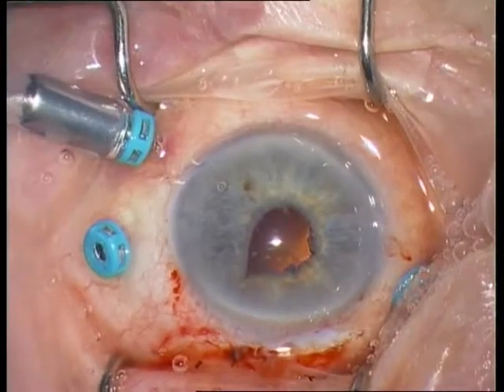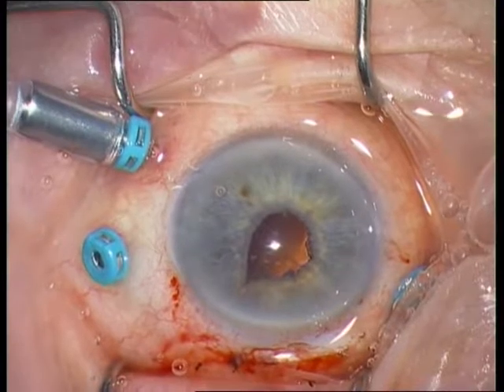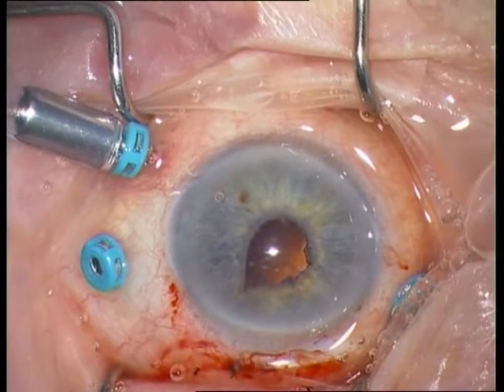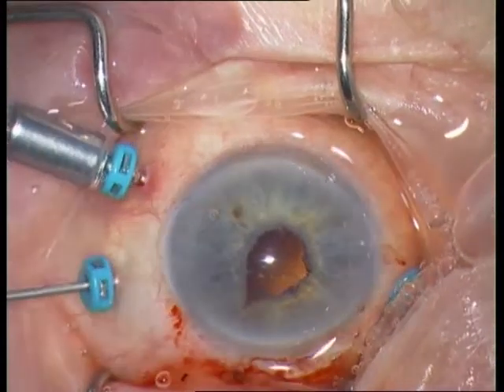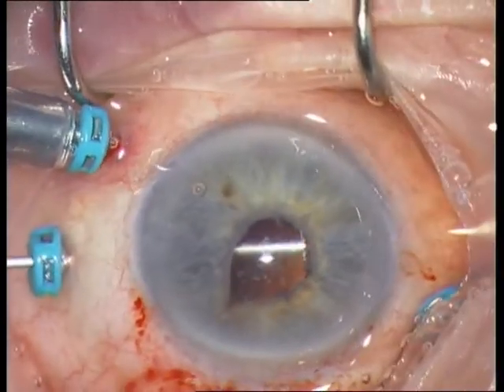Insertion of an infusion line. You can also use an anterior chamber infusion line. An anterior vitrectomy is performed from pars plana.